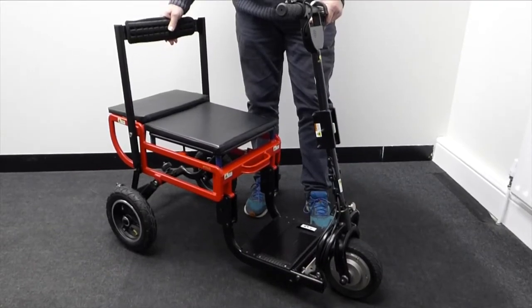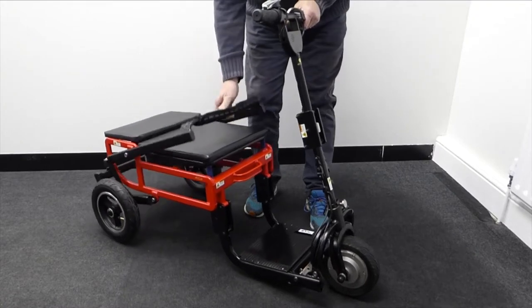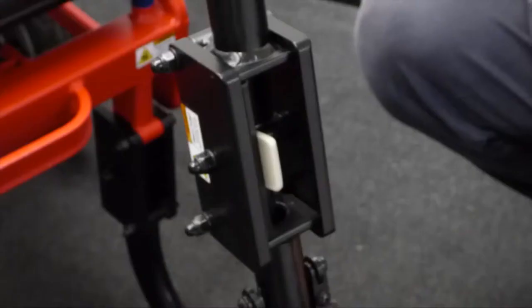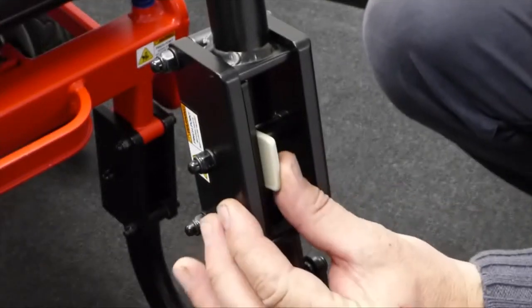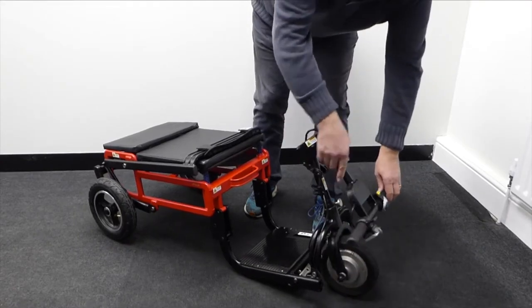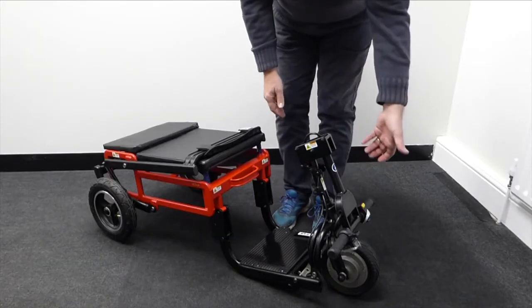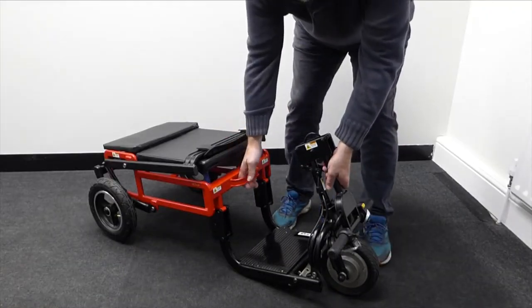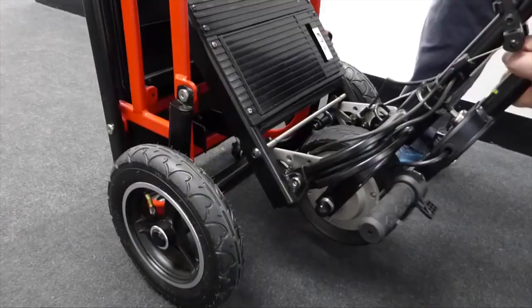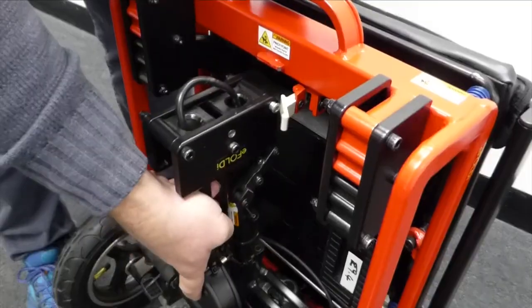To fold the e-folding light, first fold the backrest down. Press the steering tiller catch and fold the tiller until it snaps onto the magnetic plate. Grip the steering tiller and the carrying handle and snap together. Make sure that the silver catch near the carrying handle has latched the e-folding light securely.